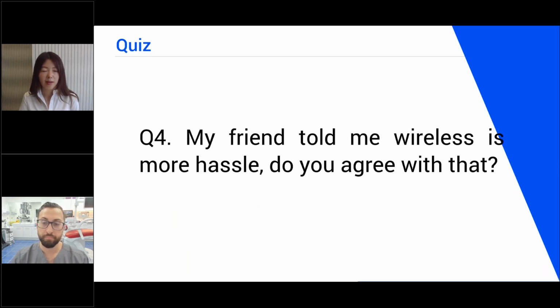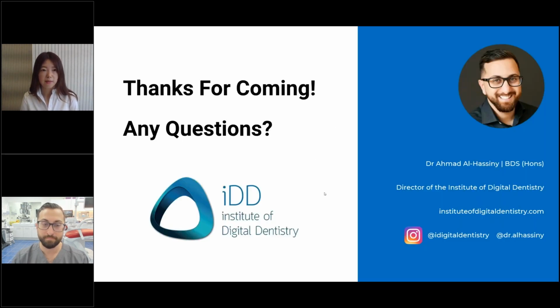Okay, question number 4. My friend told me wireless is more hassle. Do you agree with that? Yeah, look, that's a common sentiment. Wireless scanners are a little bit more hassle. Not really. I mean, the idea that they don't connect well or they lose connection is all dated knowledge from probably the first ever wireless scanner. These days, the connections are stable. They work well. They're fast. They feel just like the wired counterparts.